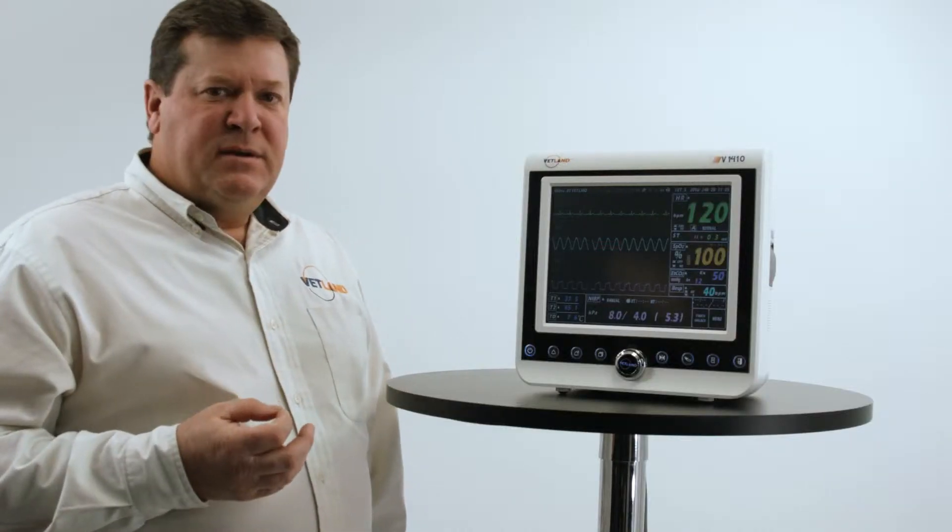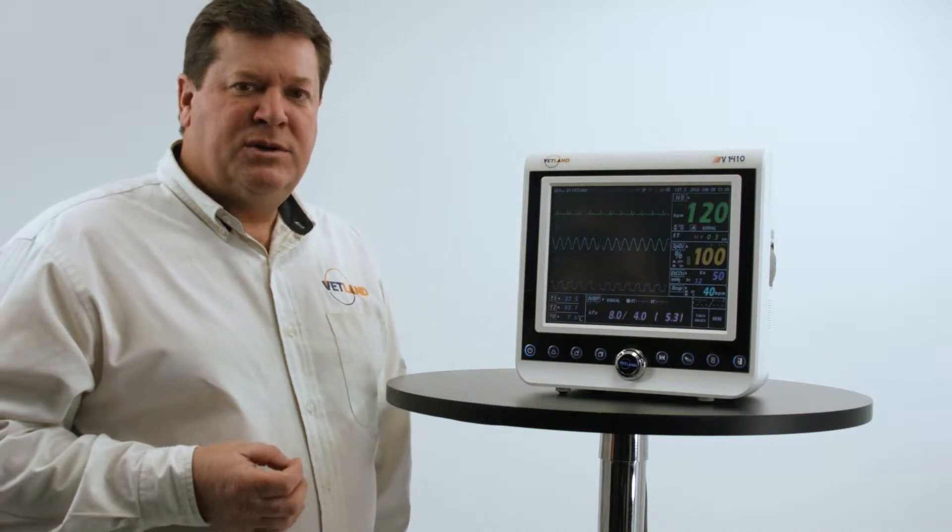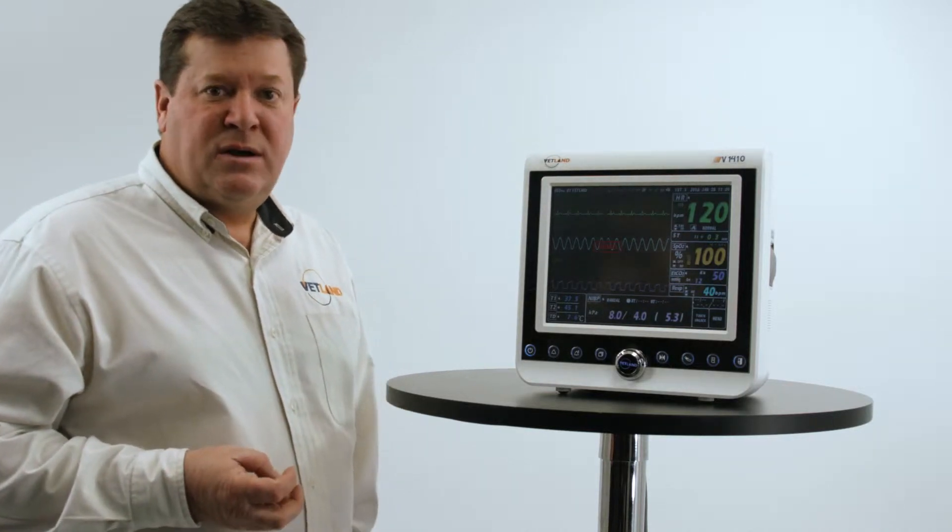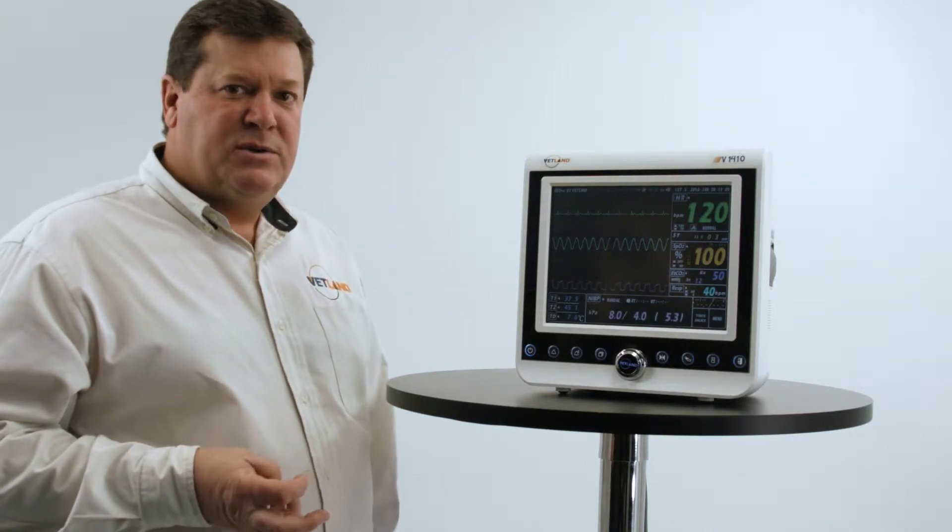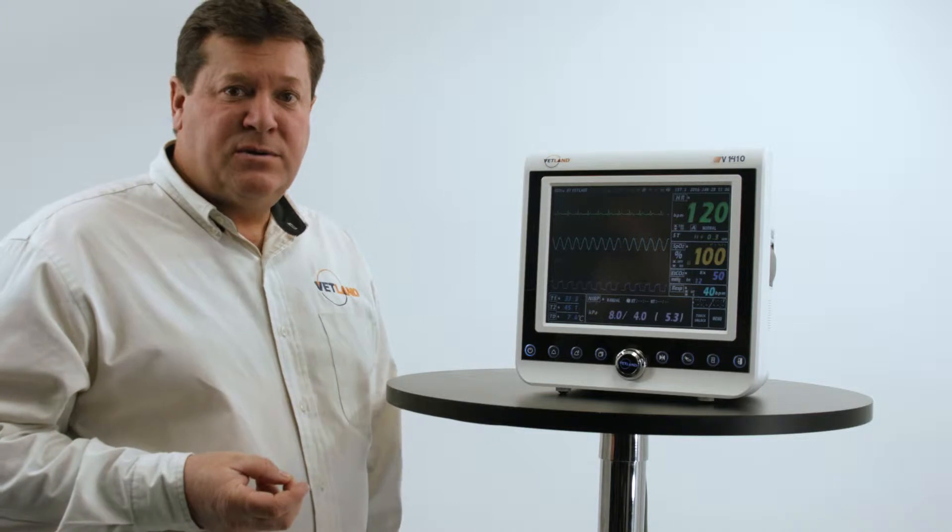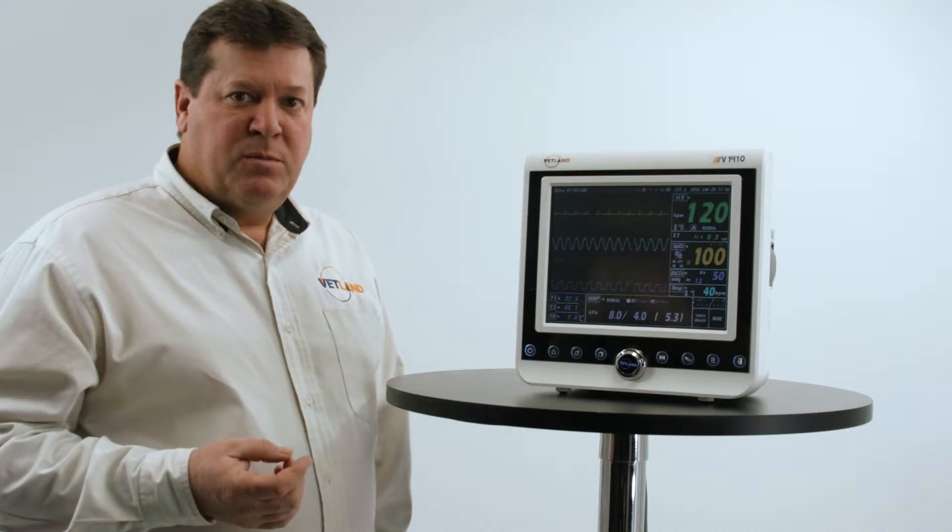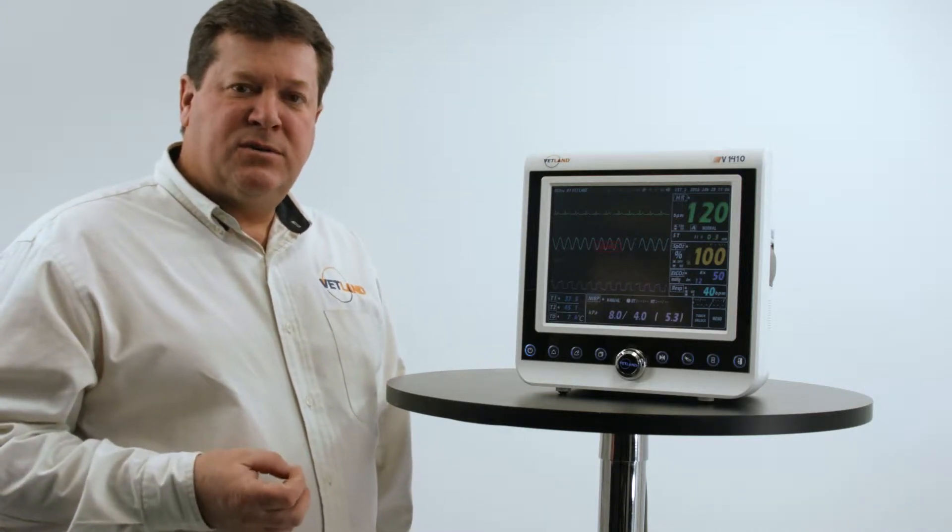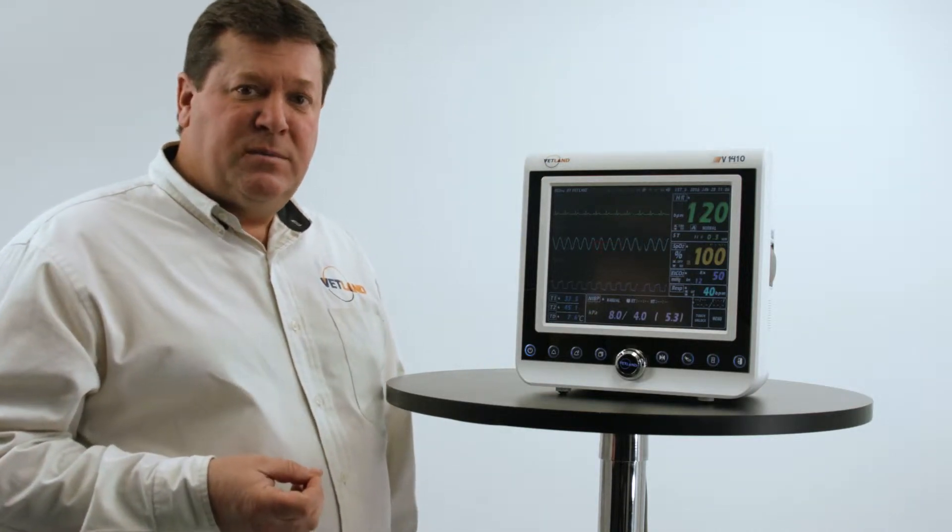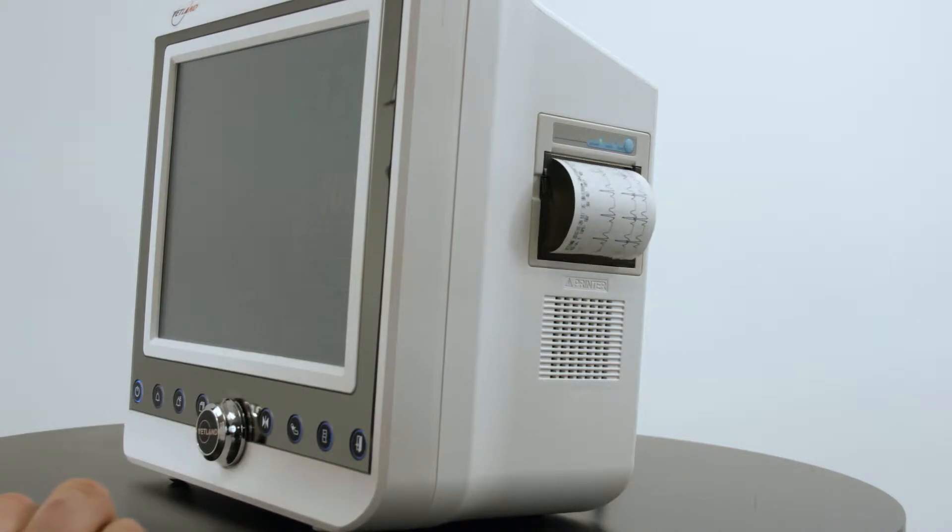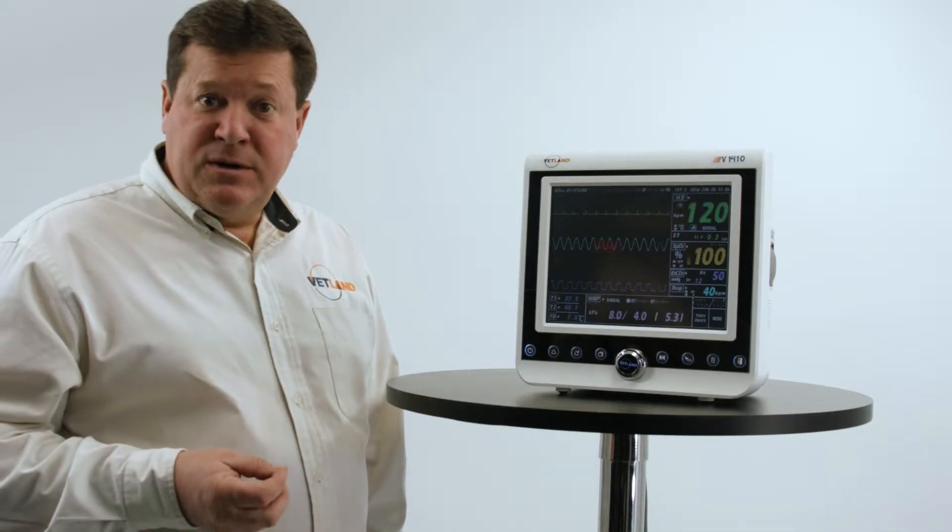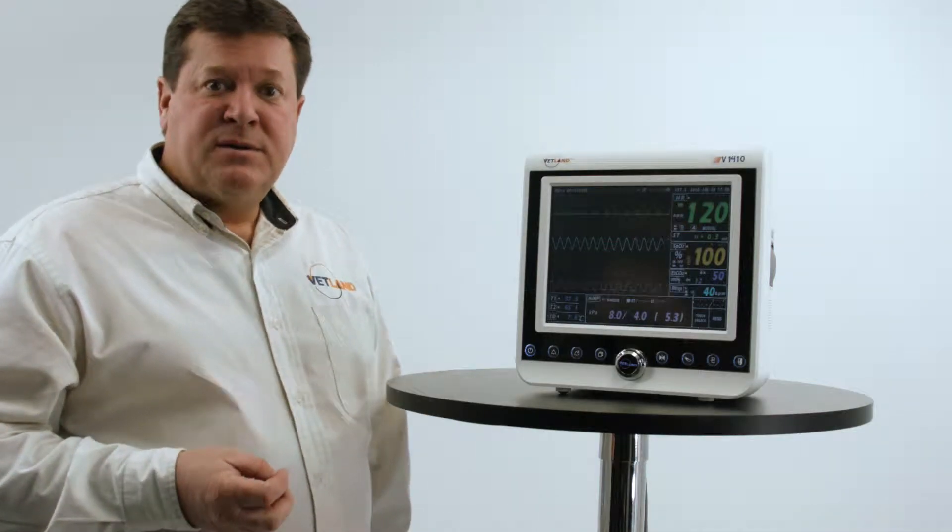The monitors have ECG, blood pressure, pulse ox, temperature, invasive pressure, optional CO2, both sidestream and mainstream, optional printers, optional touchscreen functions, and BGA out if you want to show the display on a slave monitor for bigger graphics.